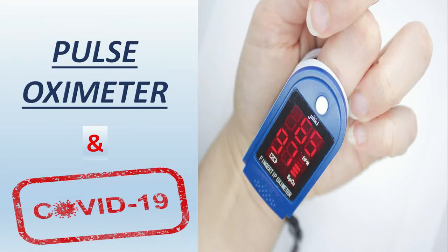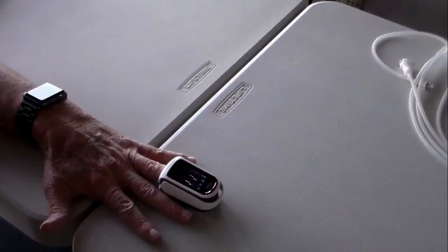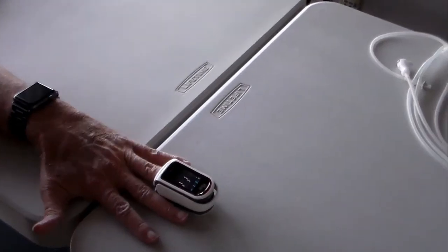In this video we are going to discuss the pulse oximeter and its use in COVID-19. A pulse oximeter is a device used to monitor a person's oxygen saturation levels quickly and easily. It is also used to measure the heart rate, also known as pulse rate.